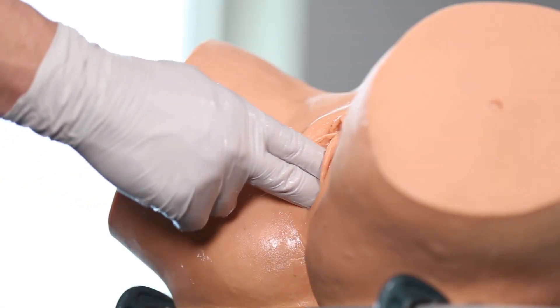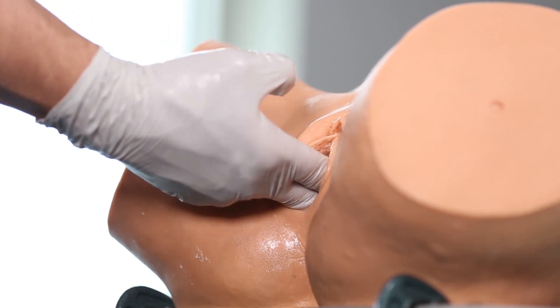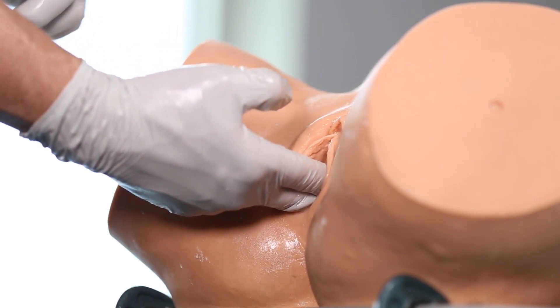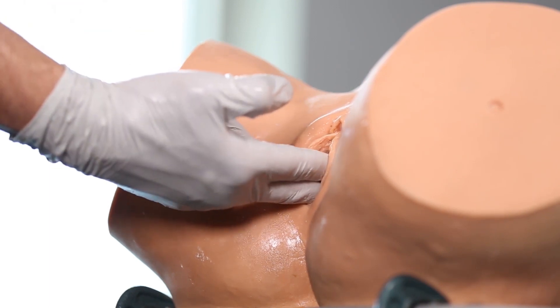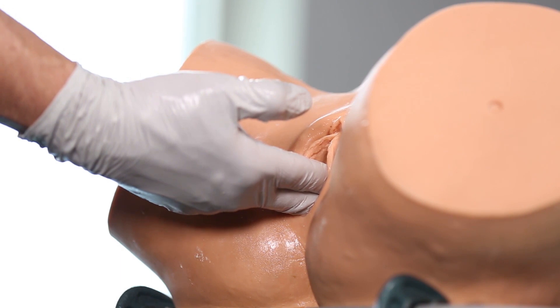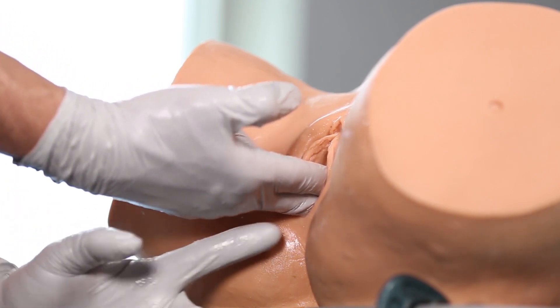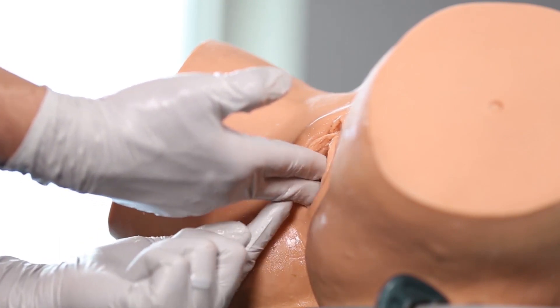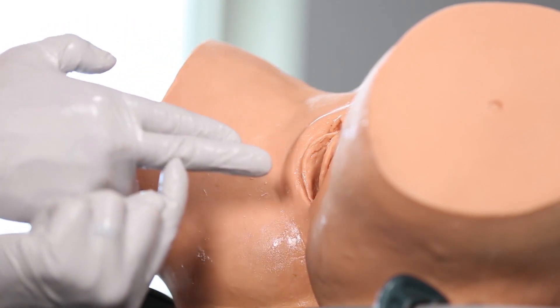Step number one is to check the position and station of the baby. In this instance, the baby is right occiput posterior at plus one station. I find the flexion point three centimeters forward of the posterior fontanelle along the sagittal suture. I rest my hand on the perineum and determine that from the middle finger to that part of my hand is approximately eight centimeters.